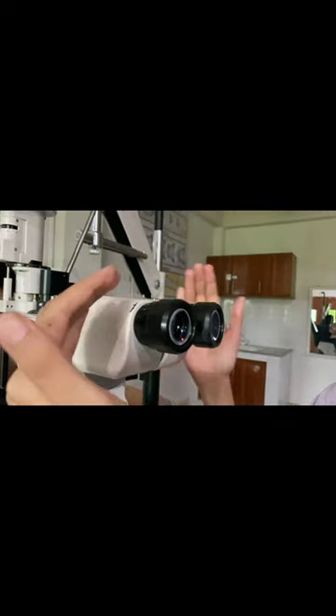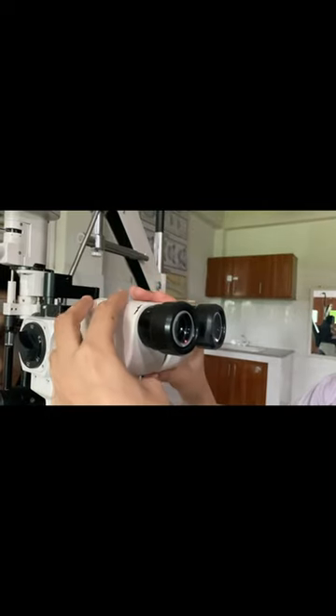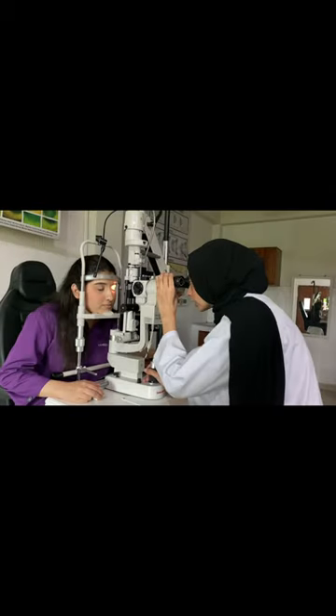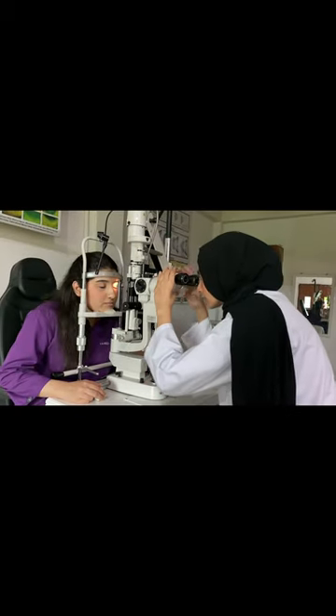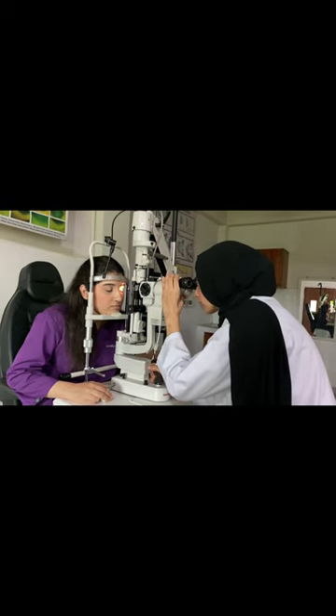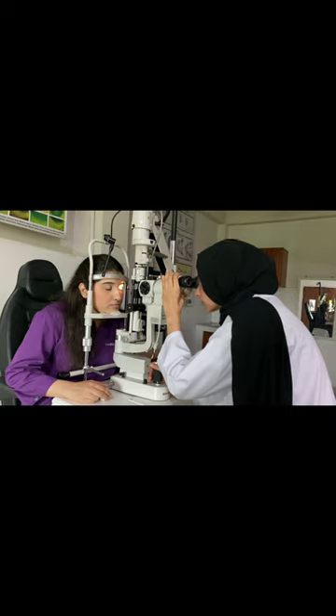We perform all adjustments for the observer so that we can have accurate focusing on the patient's eye and accurate measurements for our procedure. We gain maximum visibility by adjusting the binoculars, and we move the joystick forward and backward so that we can have the best observation.